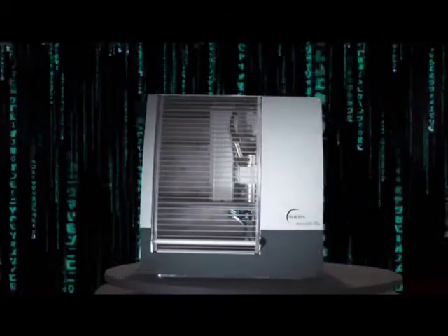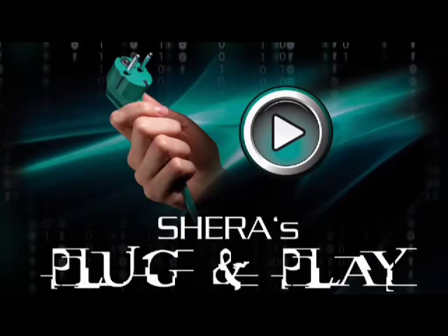The Shera EcoMill. Plug and play, and you can start with the modern dental technology from Shera.